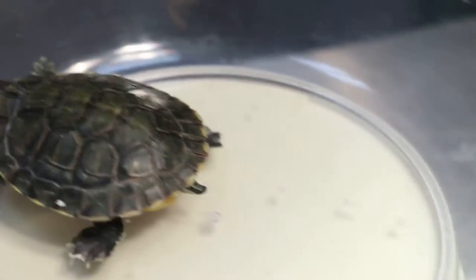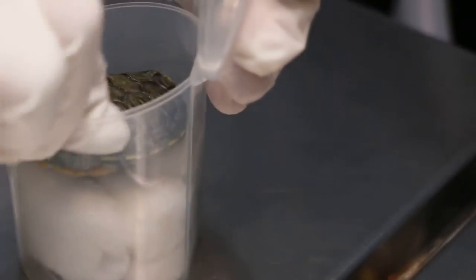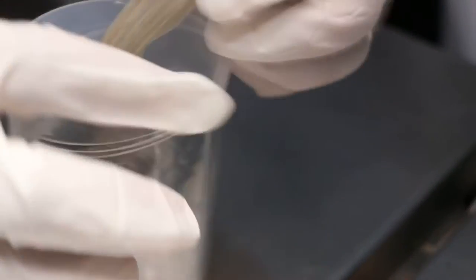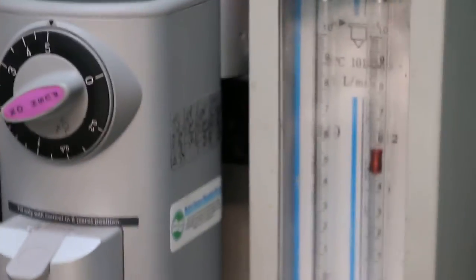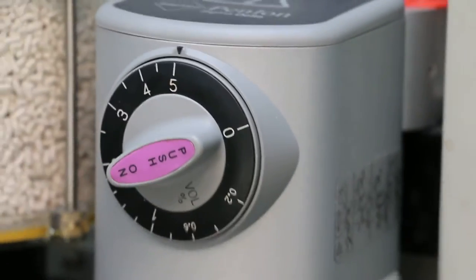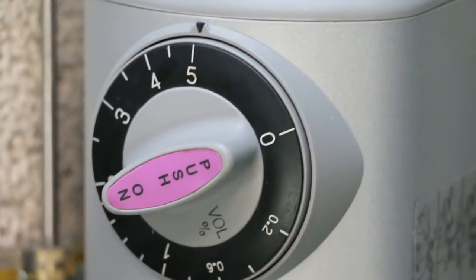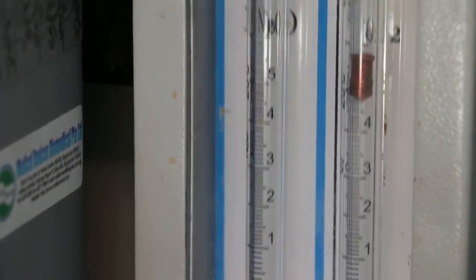So the treatment is we have to give some anesthetic gas. We put it inside the gas at 5%, 302 now, 5% gas, isoflurane plus oxygen. After weighing it was 33 grams and the flow rate about 5.